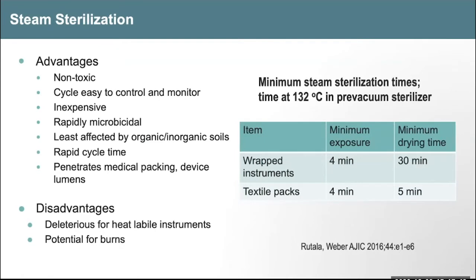So if you took an instrument out of a sterilizer and immediately touched it, there could be a burn to the worker. More importantly, sometimes people use what used to be called rapid sterilization methods, used to be called flash sterilization, and take a device out and put it directly on a patient if it's not cooled, usually in sterile saline or water. We have had patients have burns.